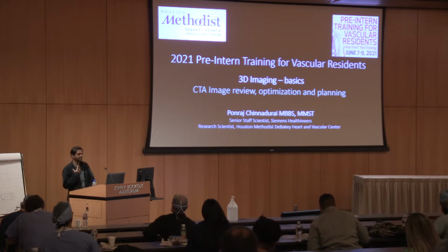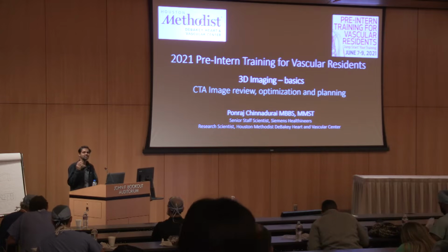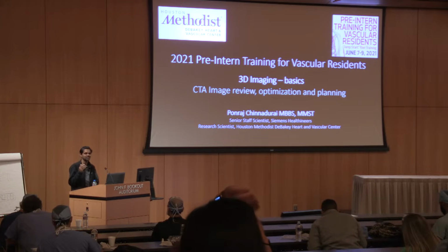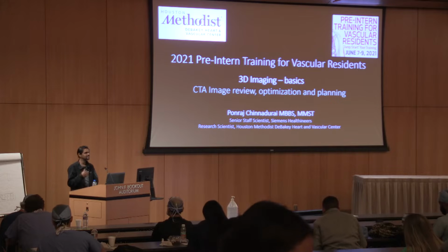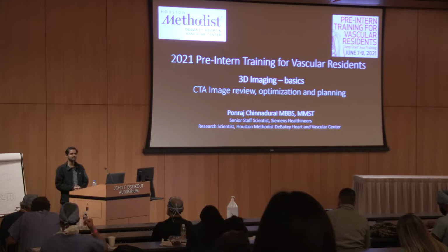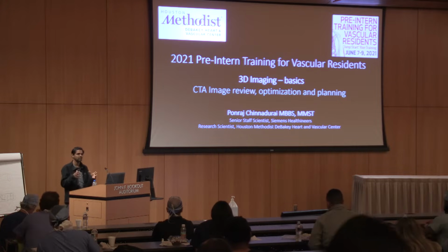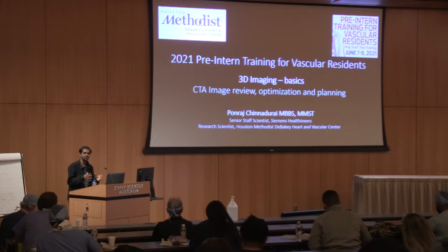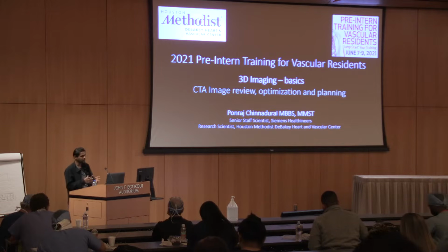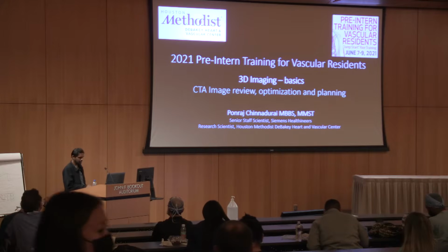So I'm not a trained radiologist, so it's not going to be one of those basic imaging physics radiology lectures. I'll try to keep it interactive. Some of the things I wanted to touch upon are the very basics of CT. We're going to limit ourselves to the scope of only CT image review, how we optimize it, and how we plan for some basic vascular procedures.